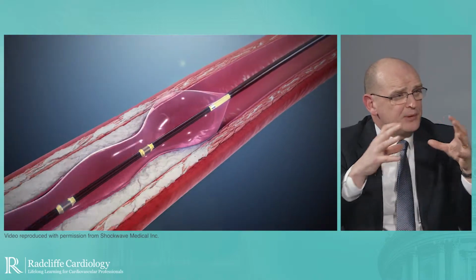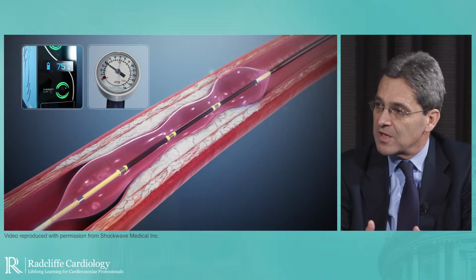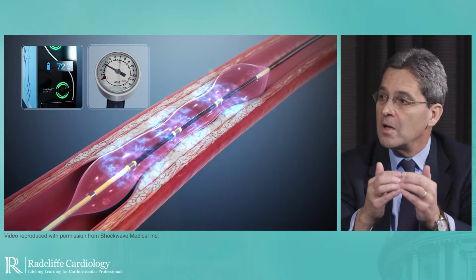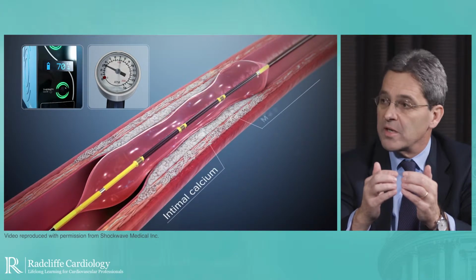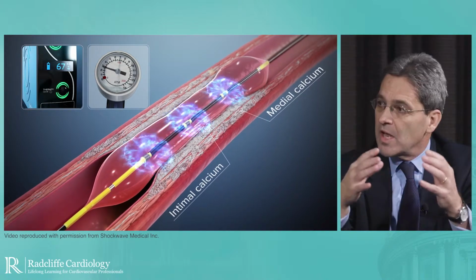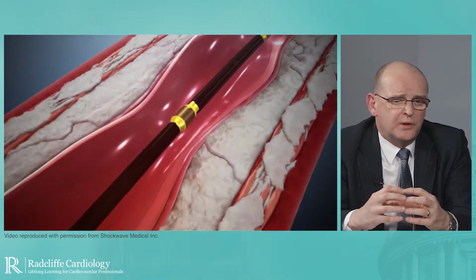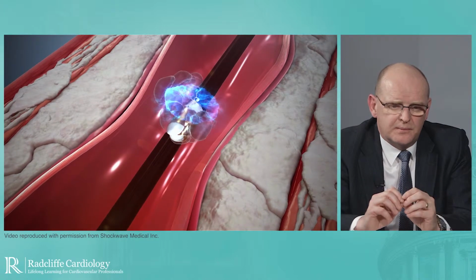So this is calcium deeper in the vessel? The calcium doesn't go away, it doesn't move, is my understanding. It's just the bonds of the calcium. So rather than having one big chunk of calcium, it breaks apart. So you have little chunks of calcium, which then will enable expansion. So we blow up the balloon, we administer these pulsed, focused sound beams.